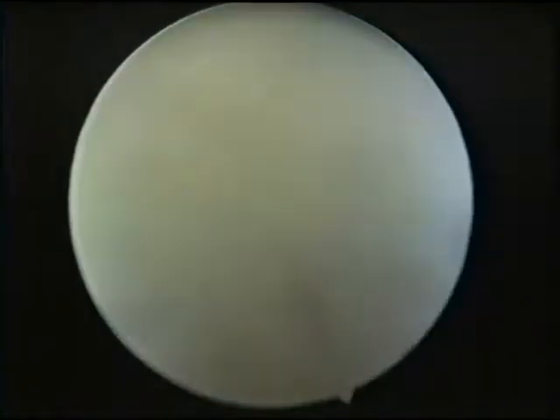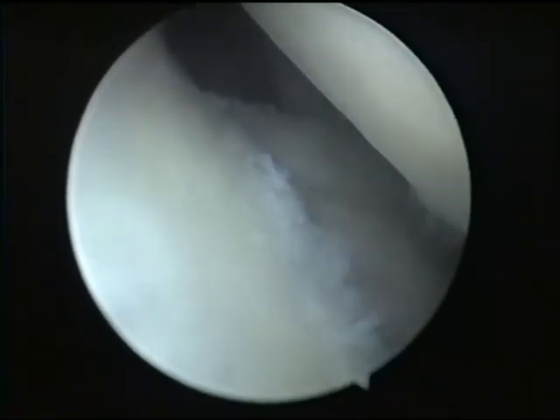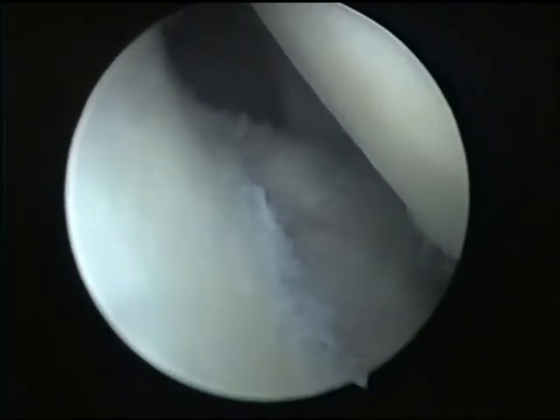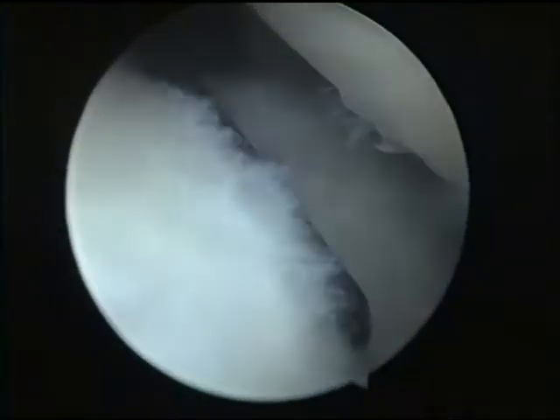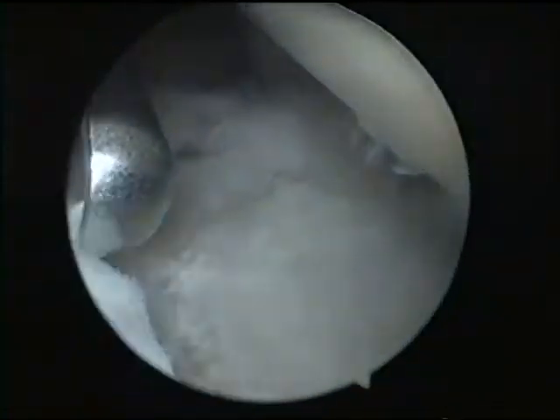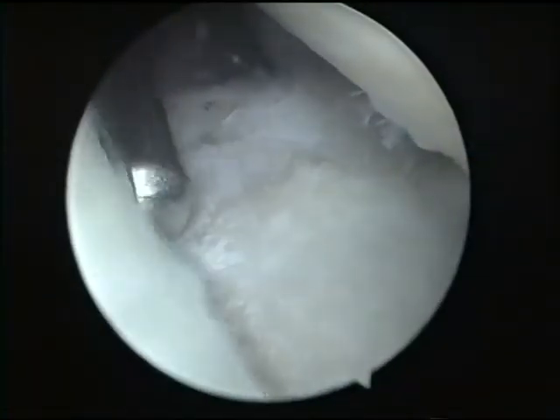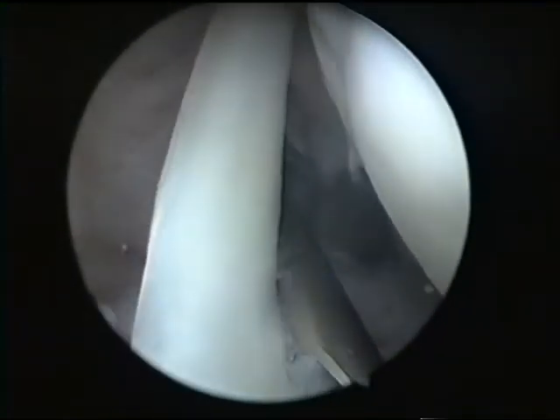Okay, that remaining rotator cuff looks like it's in pretty good shape. And there's the biceps tendon. Can I have a shaver again, please? Looks like the labrum's a little detached. Once I finish this part of the procedure, we'll put the scope in above the rotator cuff, and we'll go fishing for bone spurs.